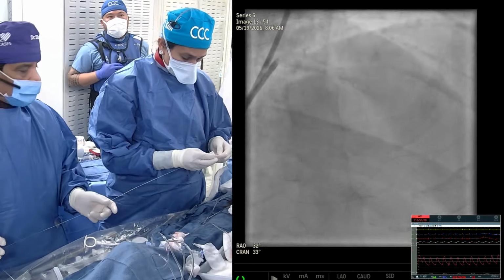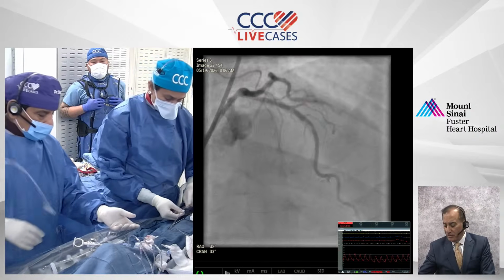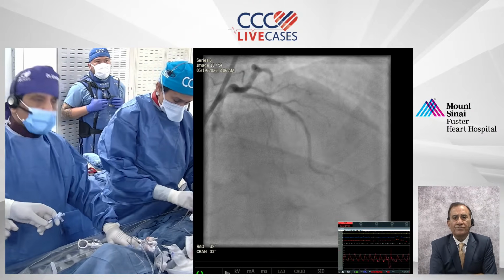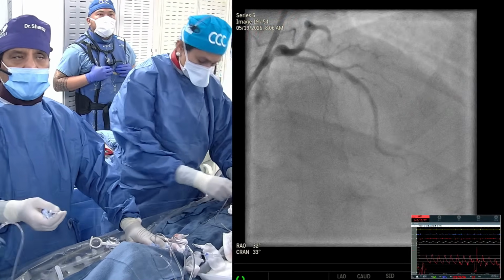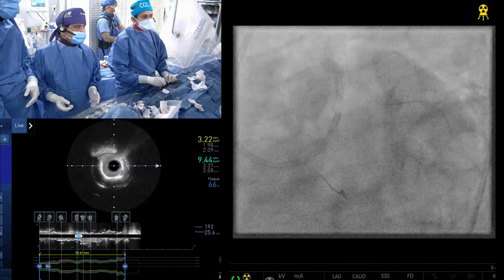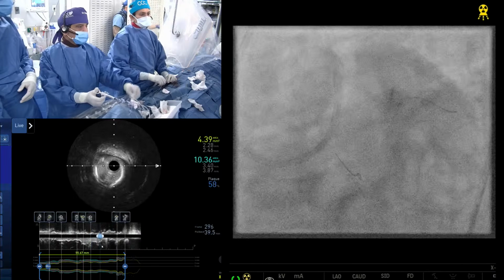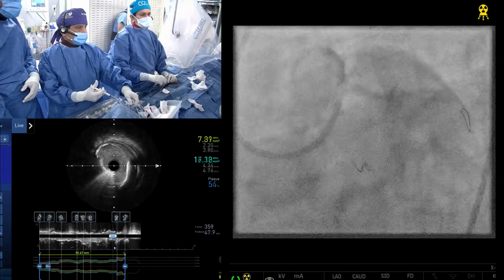There was a question posed whether there is a stent and whether we are going to be talking about a drug-coated balloon. No, but as you saw, IVUS was there. Do you want to show that LAD IVUS? Go back and show. There's nothing. Look at the whole circular calcium, no stent strut. It's like a natural stent. It's all native calcium. Okay, now. Good.